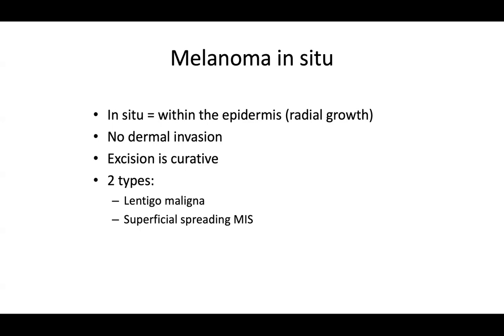Oftentimes, MIS does track down adnexal structures, and those adnexal structures can become quite deep as well. And you can have bulbous proliferation of atypical melanoma nests going up and down the adnexal structures. And while it looks almost invasive, it's still hugging the adnexal structures. So we'll take a look at some examples of that, but for definition purposes, melanoma in situ stays within the epidermis. There's no dermal invasion that is known on the slides.